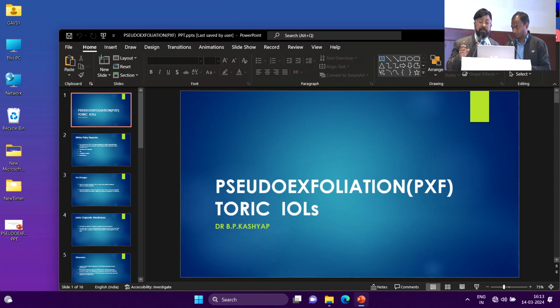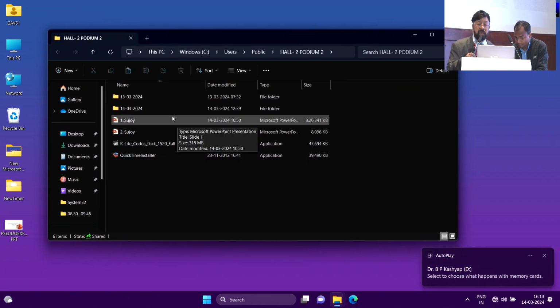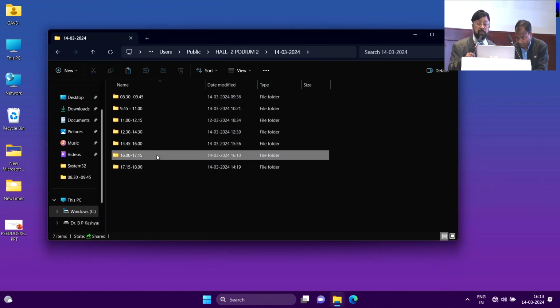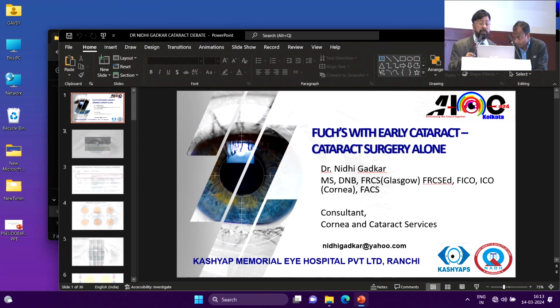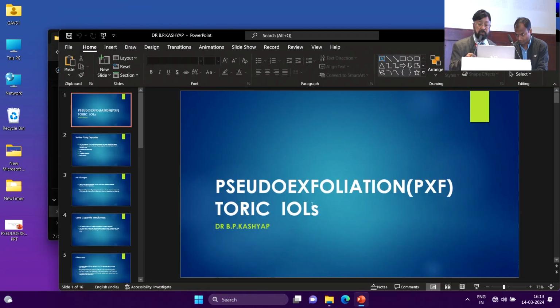So we will see that the pupil did not dilate fully, but I thought I'd be able to complete the surgery, so I did not put any ring or hook or expanders, and the incisions were quite corneal. After doing the trab and not entering the anterior chamber, I started the phacoemulsification.